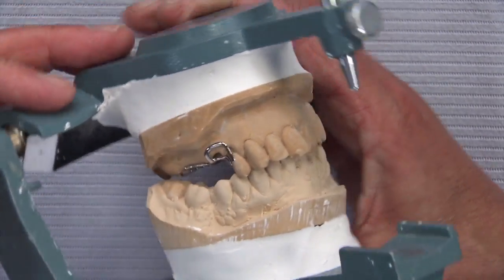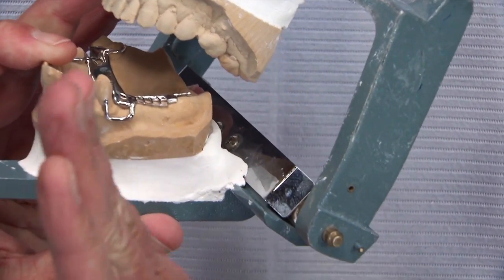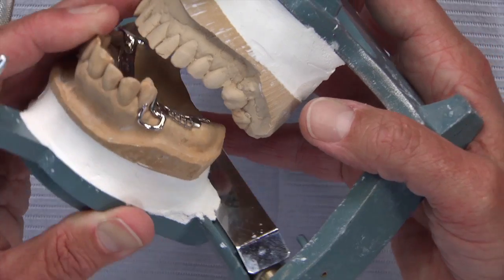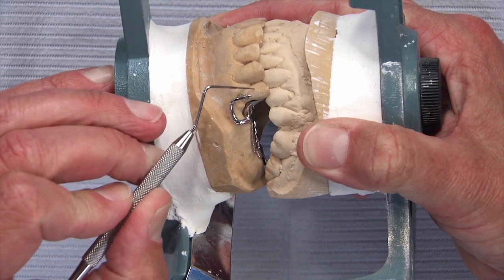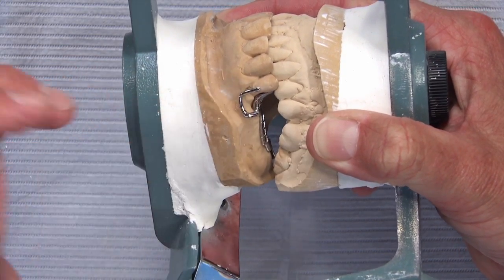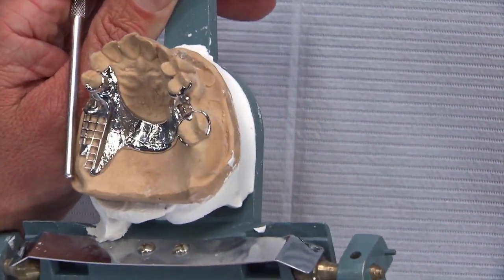The I-bar is especially suited for teeth like this one that already have some recession. When the patient loads the partial and pushes down on it, the I-bar clasp has a tendency to move toward the distal and disengage from the tooth. Whereas a typical circumferential clasp, as the patient loads the partial, moves in an occlusal direction and wants to rotate the tooth out of the socket. So the I-bar can actually be more periodontal-friendly, even though it looks like a lot of metal.